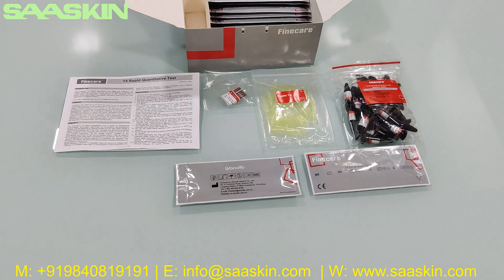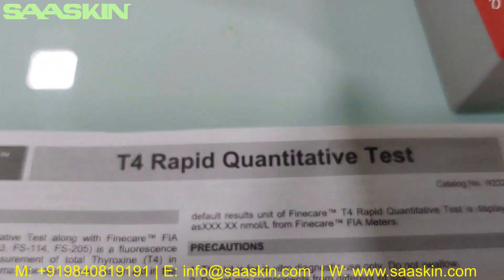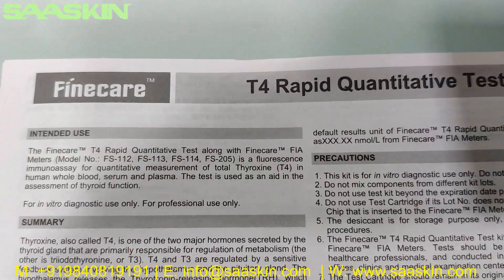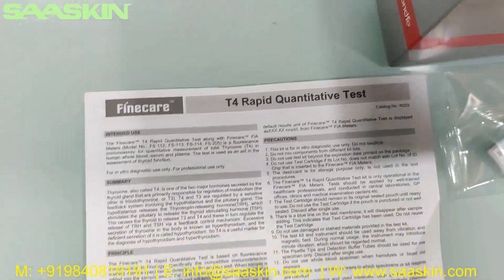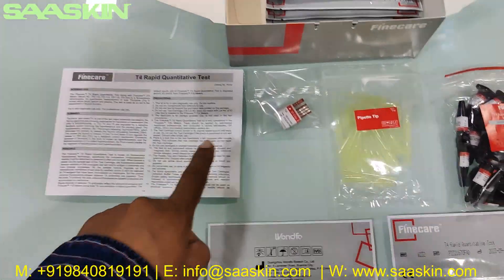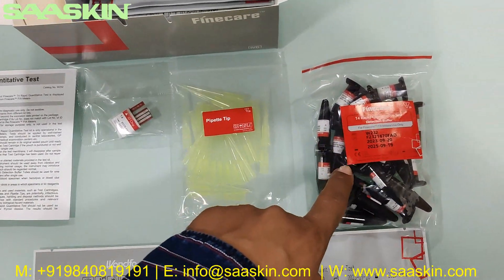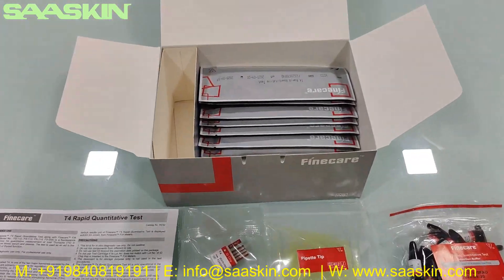Quickly to summarize: today we have seen the unboxing of the Fine Care T4 Rapid Quantitative Test, used for thyroid function measurement. In this 25 test kit pack, you get one IFU brochure, one ID chip, 25 pieces of pipette tips, 25 detection buffers, and 25 test cassettes. This is how the total test kit looks like.